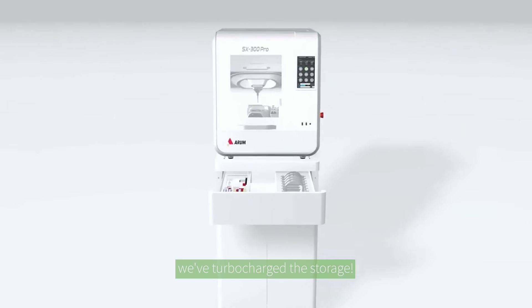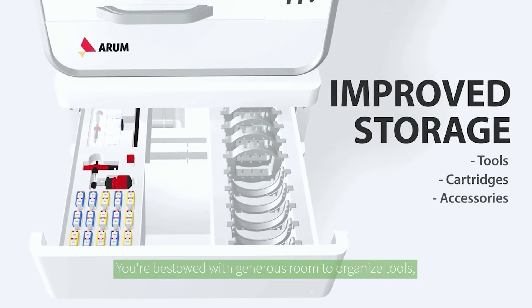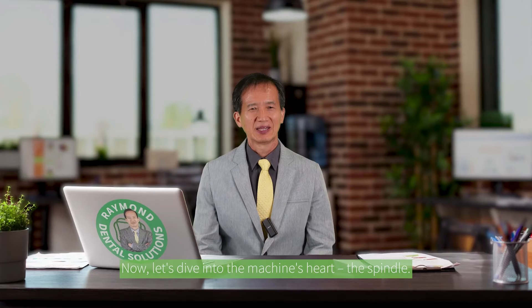We've turbocharged the storage. You are given generous room to organize tools, cartridges, and accessories, placing convenience at your fingertips.